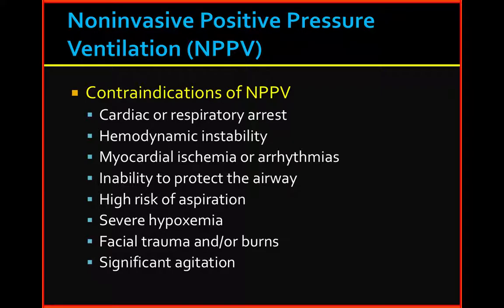Within each mode category, volume and pressure, we have two subcategories, controlled or mandatory intermittent. This refers to whether we have control over every single breath delivered or not. I know this seems confusing, but basically all I want you to know is that controlled means the machine is doing 100% of the work, versus spontaneous, where they're breathing on their own and actually starting the process. Kind of makes sense. And then there's some hybrid. Just keep it really simple.